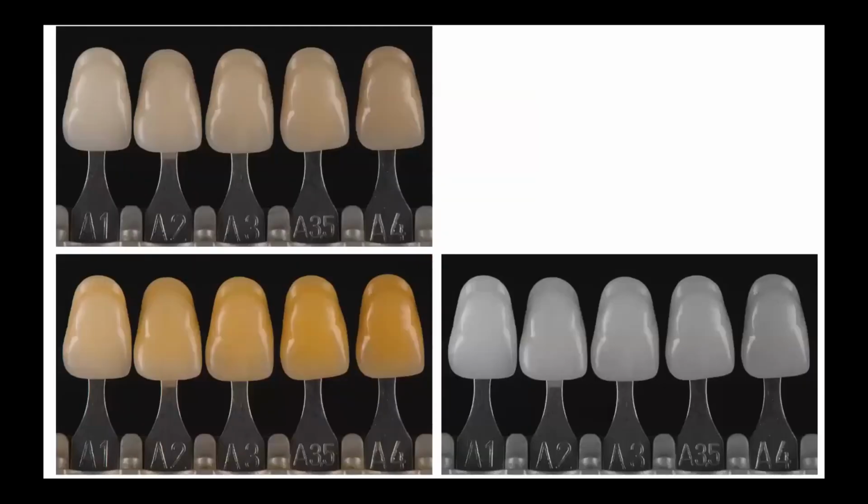But please take a closer look at the shade guide. One of these pictures is a regular one, one of them is with extremely increased saturation, and the third one is with extremely reduced saturation. So we can see the picture of our shade guide in black and white, and we can see the obvious distribution of brightness.